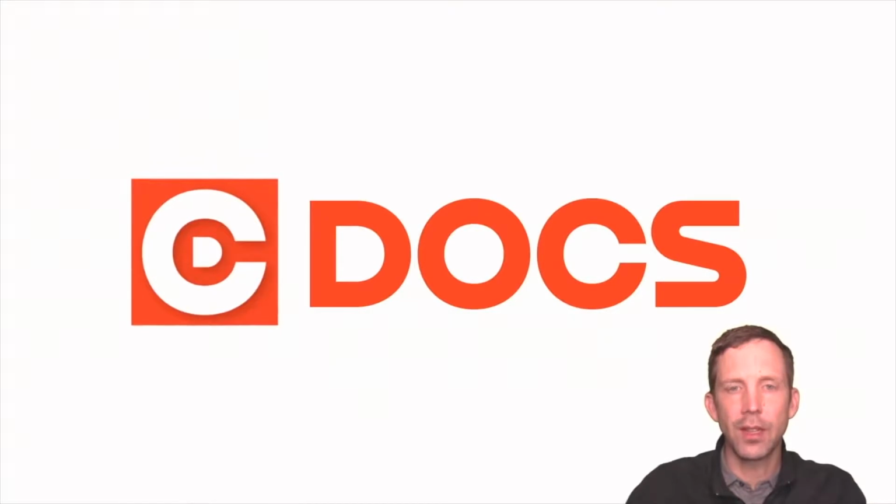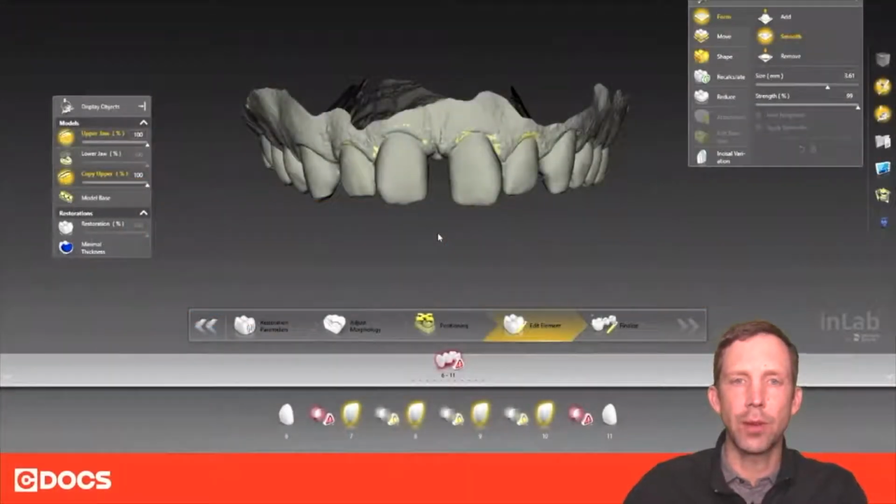Now in this tip, I'd like to talk a little bit about treatment planning more difficult anterior cosmetic cases. Now this patient came into our office with obviously all these spaces on his anterior teeth, and he wanted veneers to correct the problem. Now sometimes we need to develop strategies to convince or create value for this patient on more comprehensive care to get a better result.